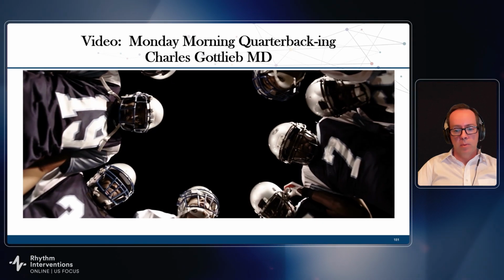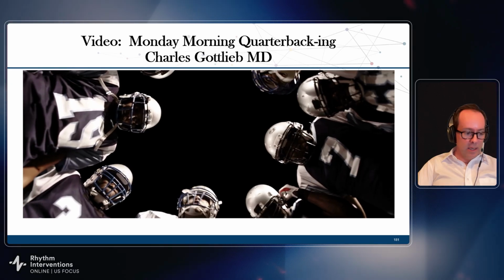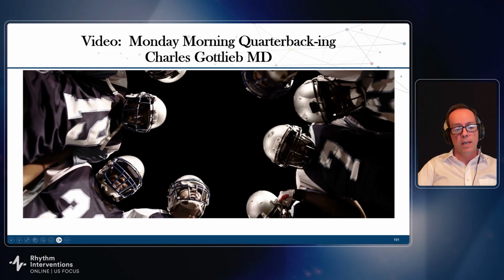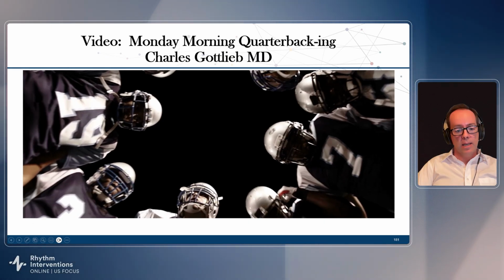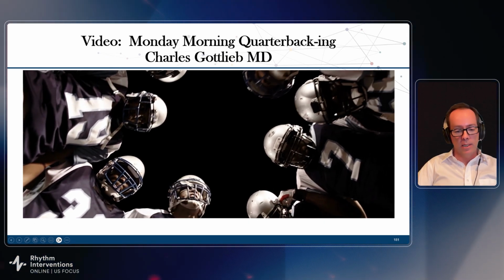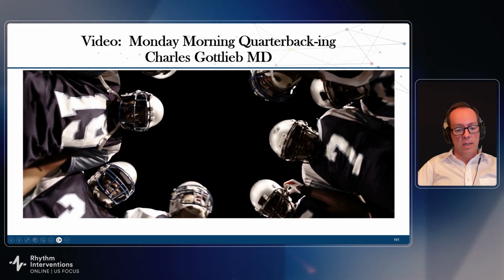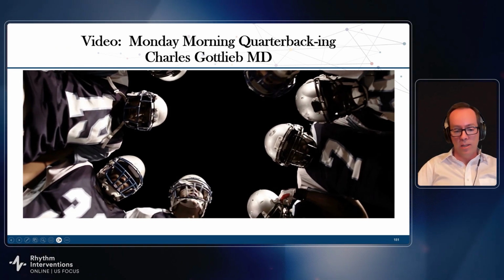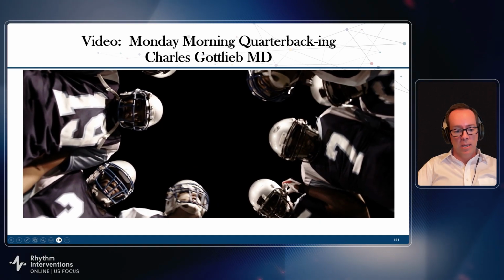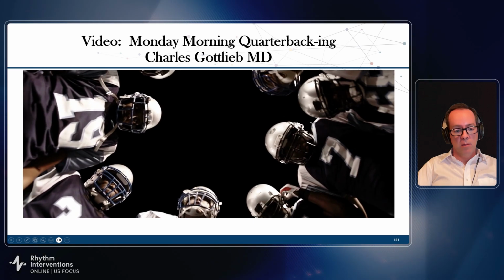I was dismayed to find out a couple of days ago that I've tweaked my practice a lot for the SICD, and I have a beautiful recording that is not allowed to be played because it's involved in the IDE trial. So instead, the good news is we're going to play Monday Morning Quarterback, and Dr. Gottlieb is going to be our, shall we say, victim.